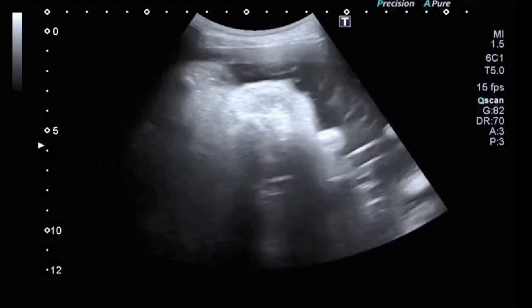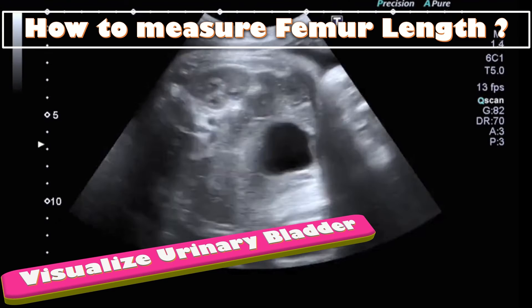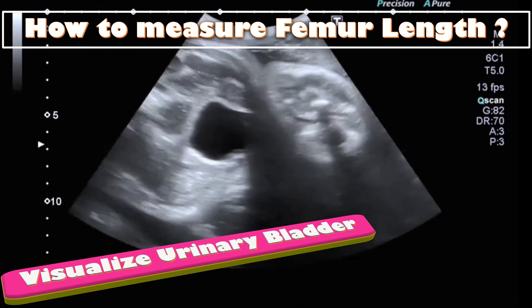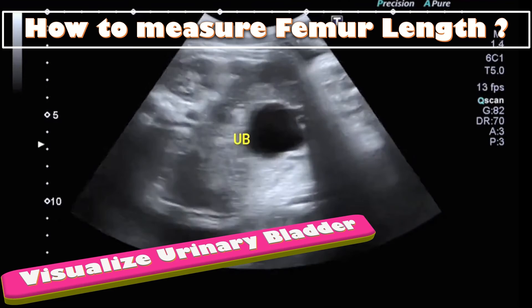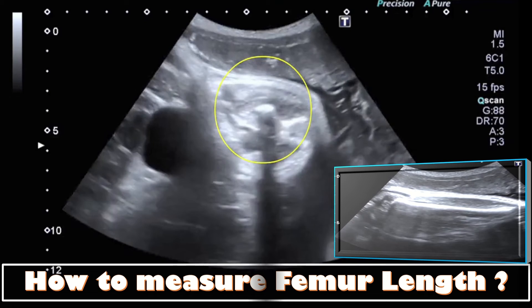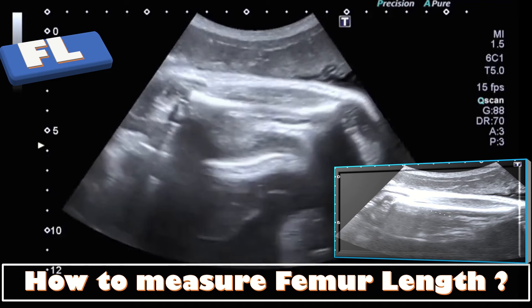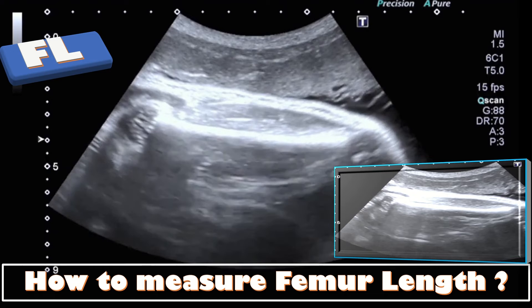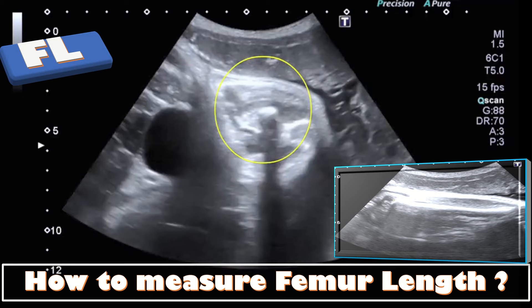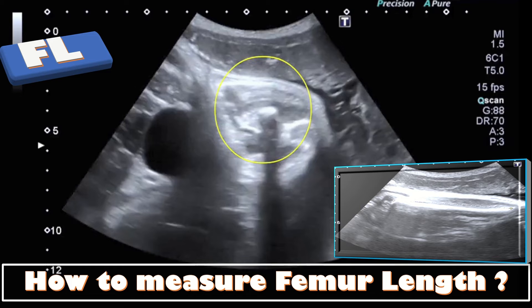To measure the femur length, slide the probe caudally from the fetal abdomen until the urinary bladder is visualized. At this point, a cross-section of the femur is usually seen. Keeping the anterior femur in view, rotate the probe slowly until the full length of the femur is obtained. Identify the endpoints of the femur and measure it from one end to another, excluding the trochanter.